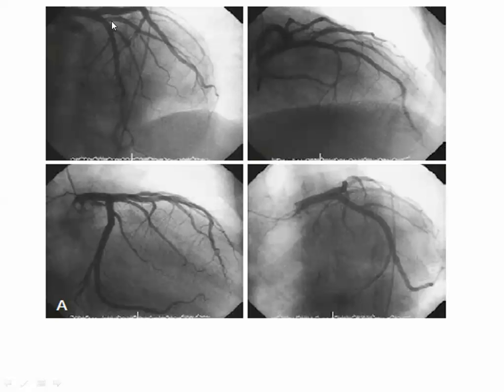And this is vessel what? LCX. This is the left. Okay, LCX. So what's this? OM. Yes, OM2. Proximal, mid, distal. And no supply to the inferior, so it's not dominant.